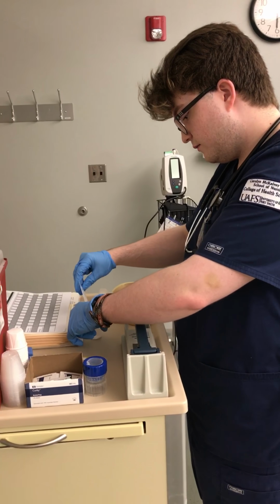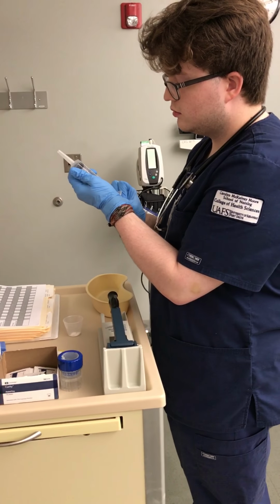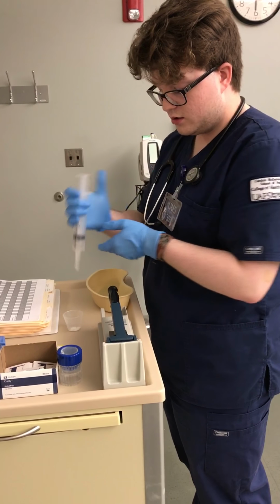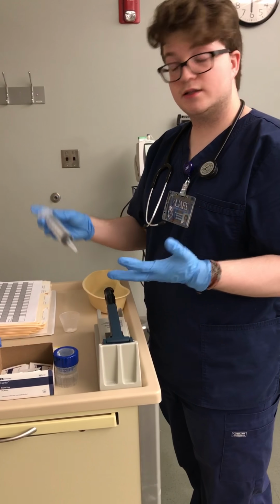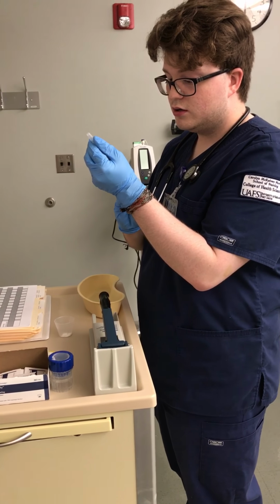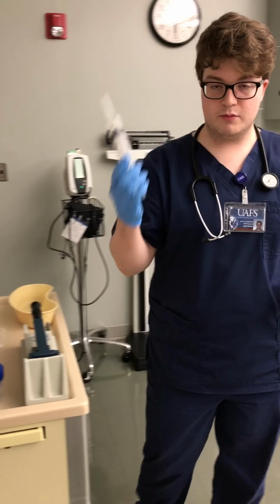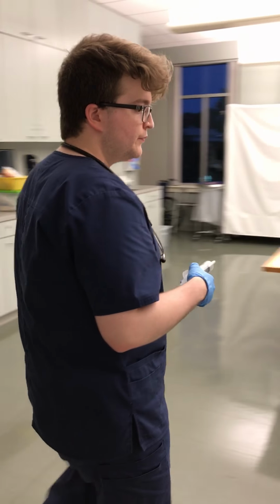And I would draw 15 milliliters of fresh water. I would just put that in there, mix it up, make sure it's dissolved. I draw the medication back up into the syringe. Should yield about 15. Now we get rid of that cup. So then I would bring this over to the patient's room.